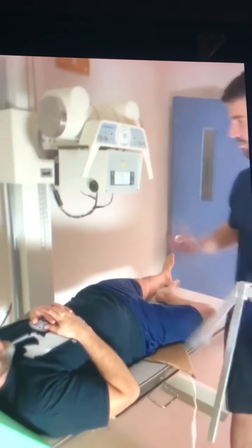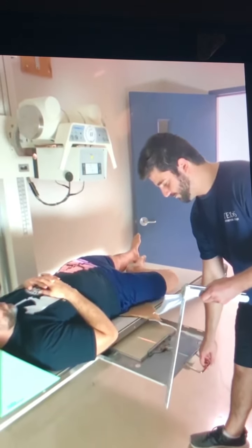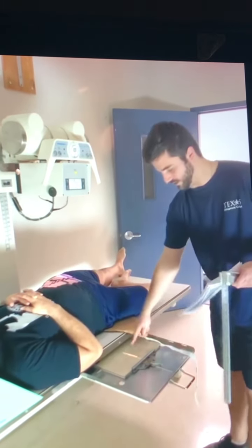We're going to put a marker inside the light. His right side's down, so I want to put it on his right side. RPO, his right posterior oblique. We're using a 10 by 12 film. Collimate it to the film. Good.